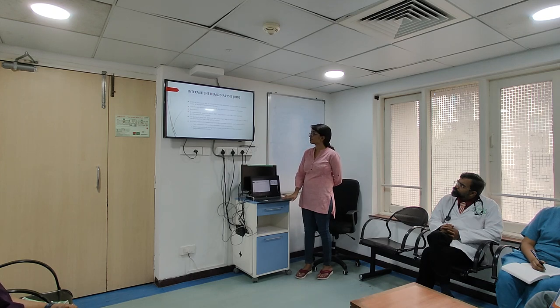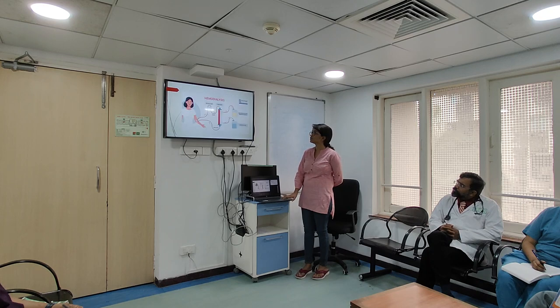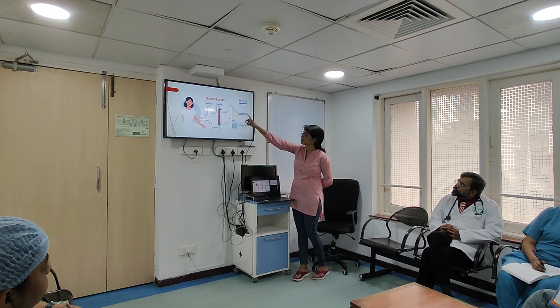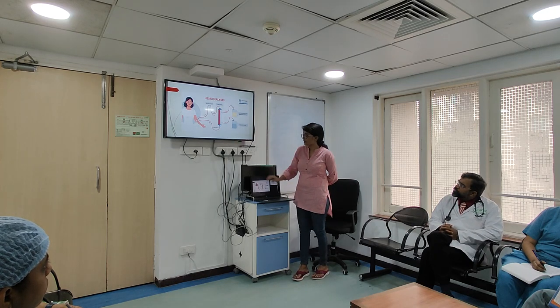Intermittent hemodialysis is not preferred in hemodynamically unstable patients because of the high clearance with resultant decrease in plasma osmolarity, and the short treatment time during which the volume is removed can result in decreased blood volume. So this is the picture. We are using a diffusion method. The blood will be removed to the roller pump, the dialyzer solution is there, then the filtered blood will go back to the patient.